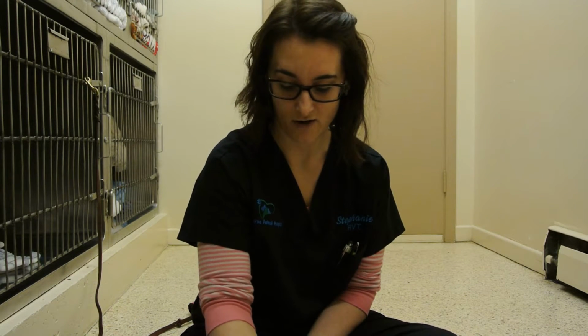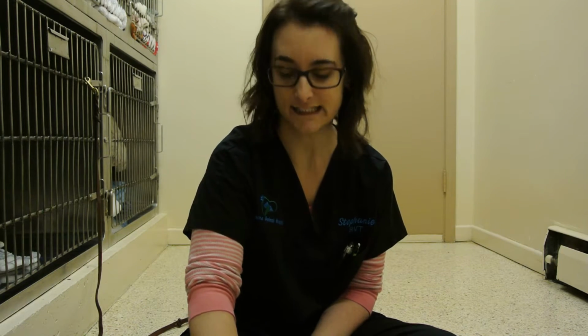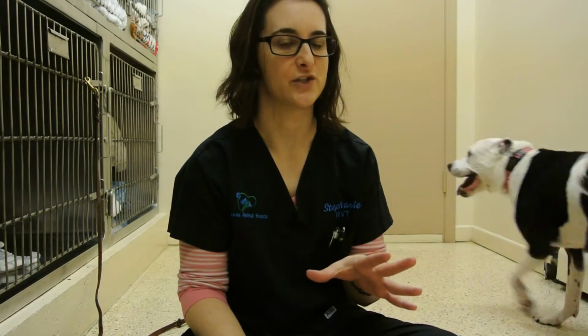Again, I decided to do a little video diary update on Gracey. Back in December, we discovered a tumor on her chest, which turned out to be benign. However, it is quite large. Since then, she's been displaying some other clinical symptoms of other issues going on. So Gracey's here for an ultrasound today.